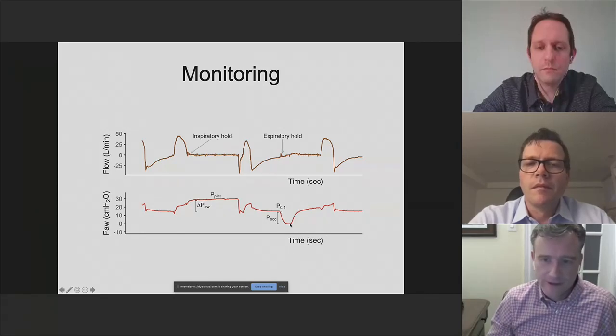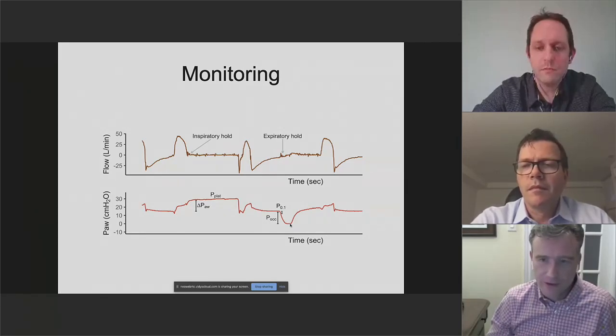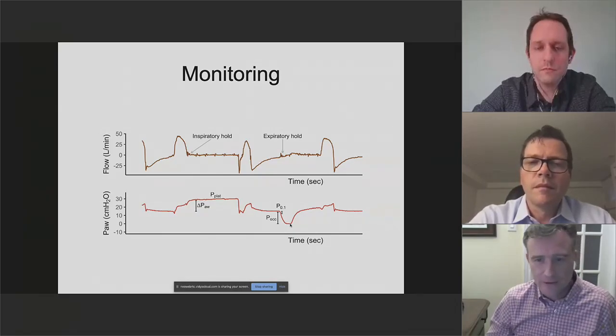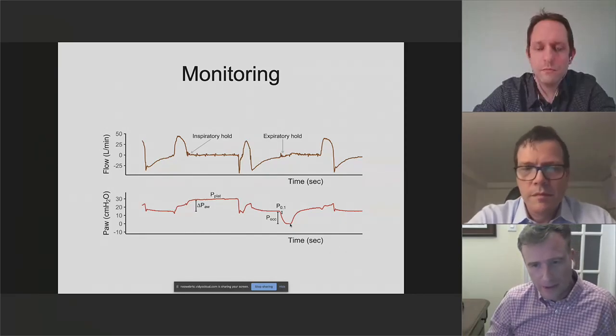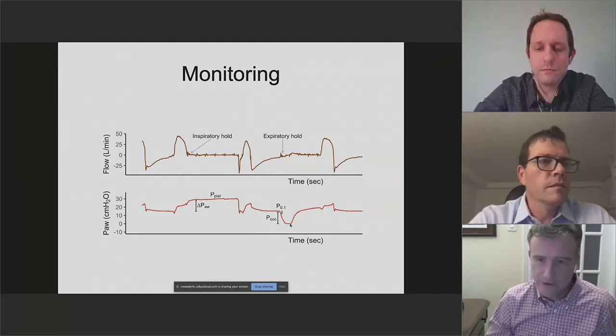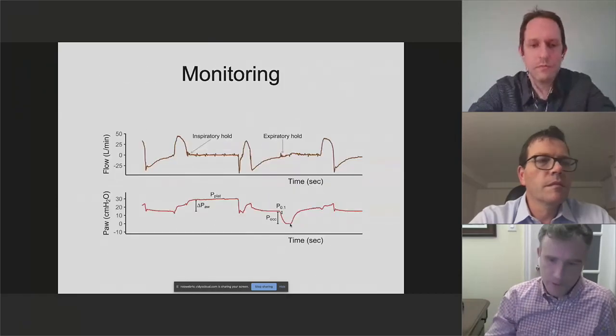that reflects the effect of the respiratory muscles on airway pressure against the closed valve. And so this allows you to quantify indirectly the patient's inspiratory effort and also estimate how much pressure the patient's breathing muscles are applying to the lungs. So there's a very nice paper by Michele Bertoni and colleagues that validates this measurement and explains how to use it.